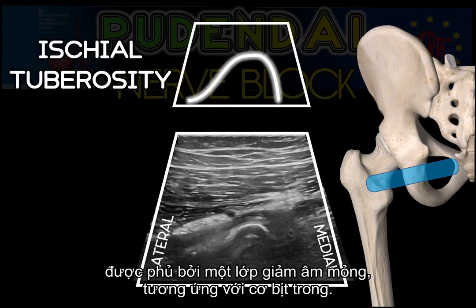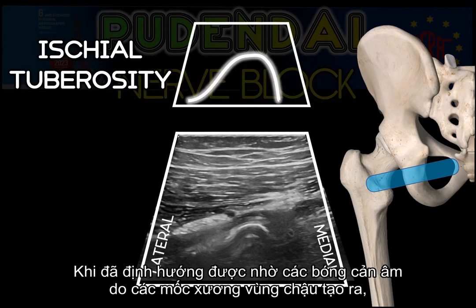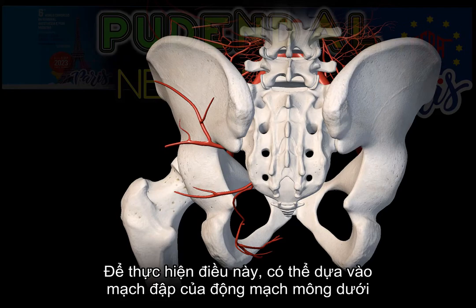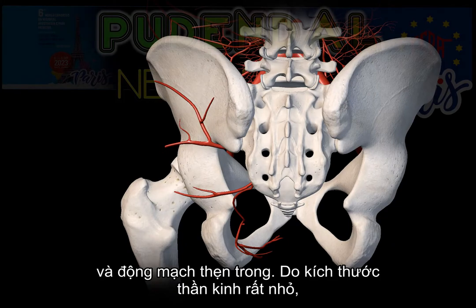The ischiatic tuberosity is identified as a rounded hyperechoic line covered by a thin hypoechoic lamina that corresponds to the obturator internus muscle. Once we are able to orient ourselves, guided by the acoustic shadows generated by the bone projections of the pelvis, we will go in search of our target, the pudendal nerve.